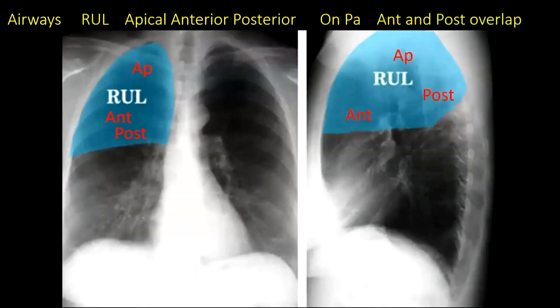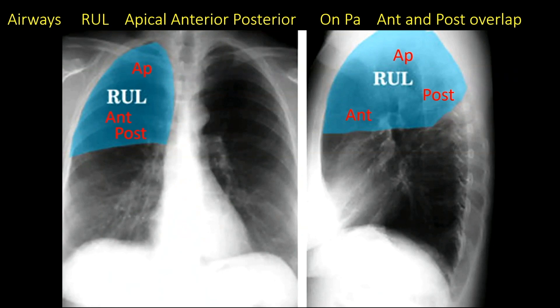When you go over these segments and where they would appear on the chest radiograph, the apical segment is clearly differentiated from the anterior and posterior on the PA film. On the PA film, the anterior and posterior may overlap each other. When you combine it with a lateral film, you can clearly see the anterior and posterior segments are easily differentiated.